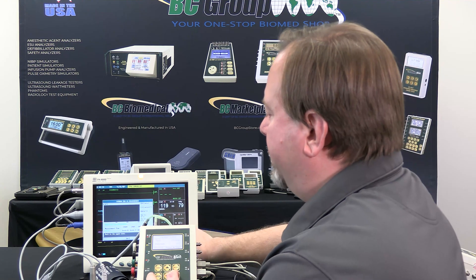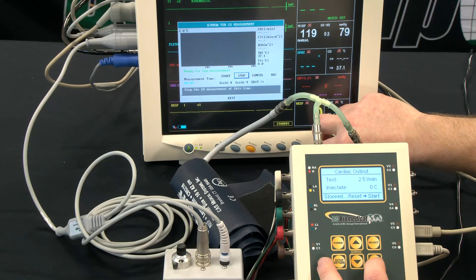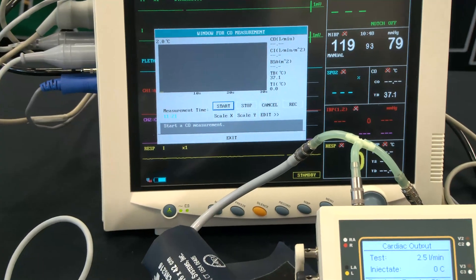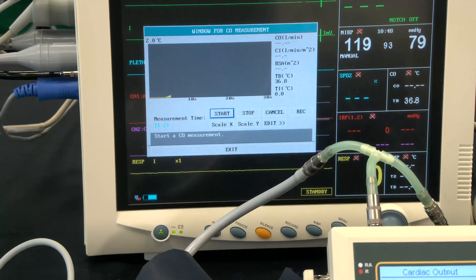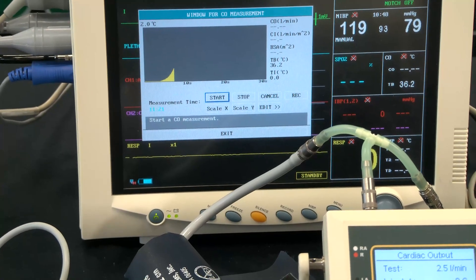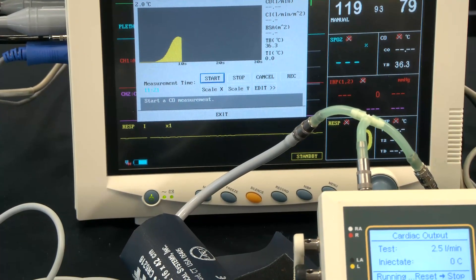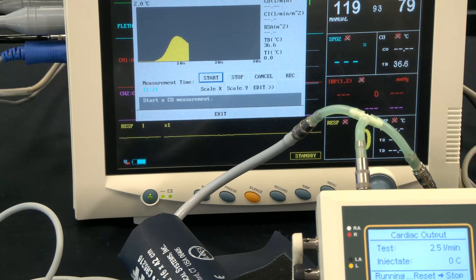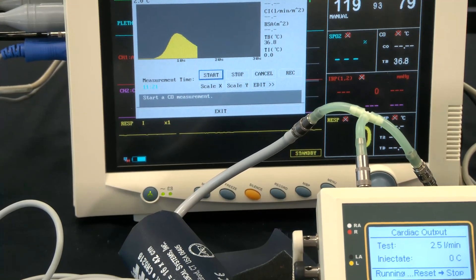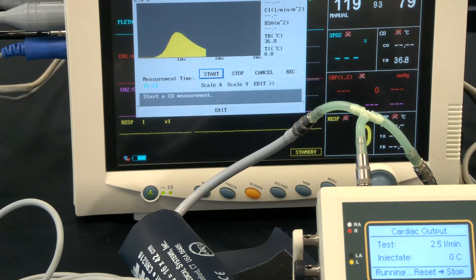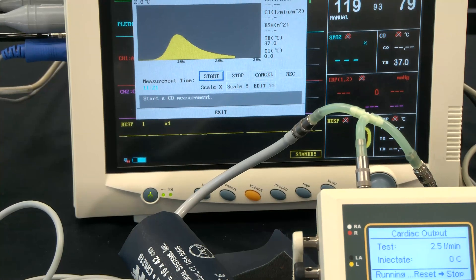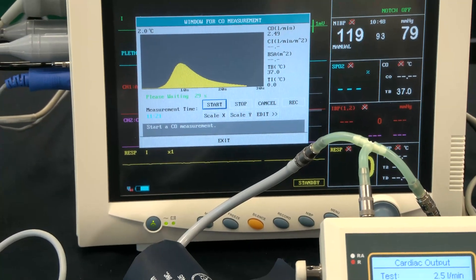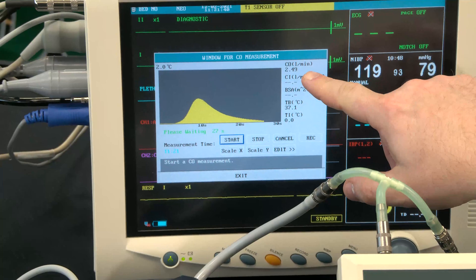We have to start the monitor first so that it's ready for the measurement. Now we start the simulator and it will display the change in temperature as the simulation is run. In this case we had 2.5 liters per minute selected on the NAVP-1040, and the monitor should come up with a similar measurement. And we got 2.49 on the monitor.